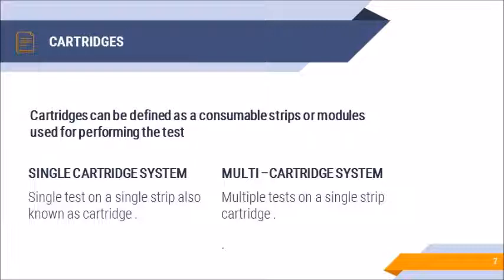Depending on the need of the hour, single cartridge systems or multi-cartridge systems are chosen. Heavier workloads go for the multi-cartridge system, while the lower workloads go for the single cartridge system. Multi-cartridge systems are also chosen on the advantage of having multiple tests on a single platform, not only blood gas but also other parameters which are critical for critical care units like ICUs and NICUs, etc.